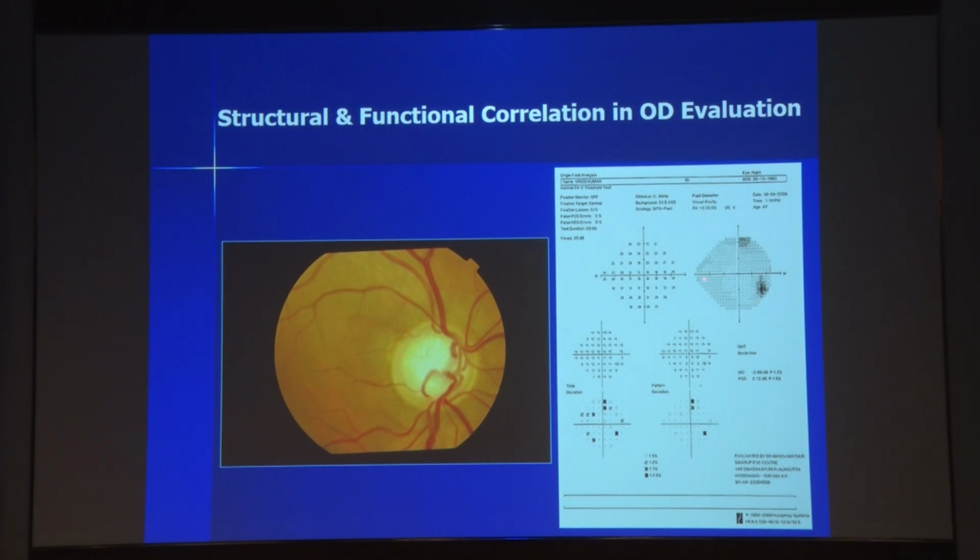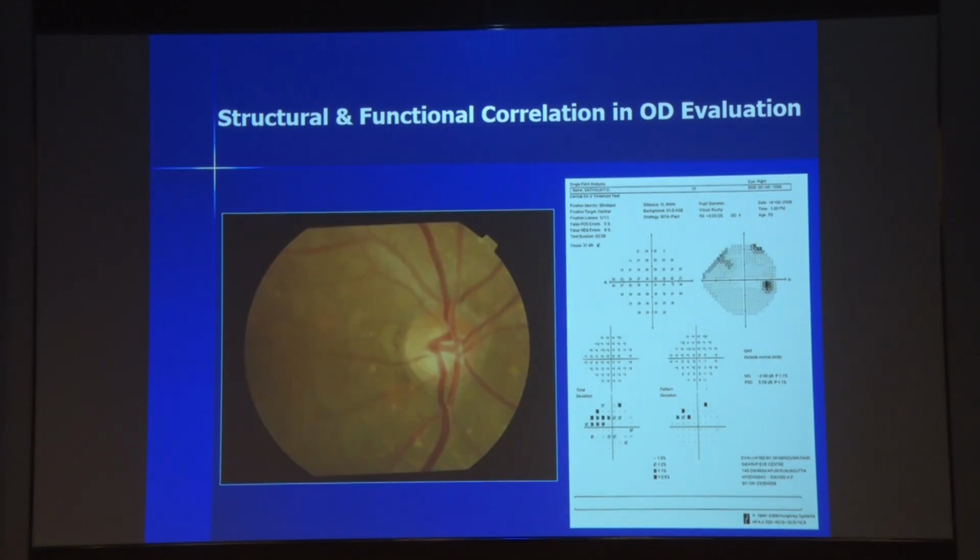It is likely to be normal. So this disc, 3 to 4 decades back, was labeled glaucoma, which is not the case now. If you see here, this is a normal size disc. There is a notch here. The inferior neuroretinal rim is thinner than the superior neuroretinal rim. Because of this notch, there is an early focal glaucomatous defect in the visual field, a superior nasal step. This is the way you must see.